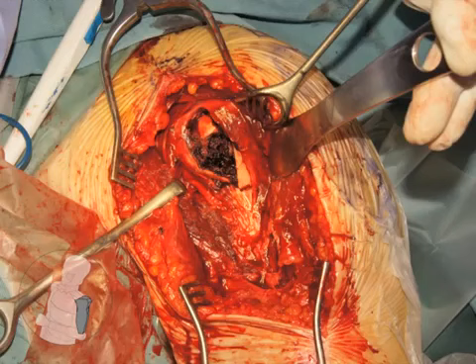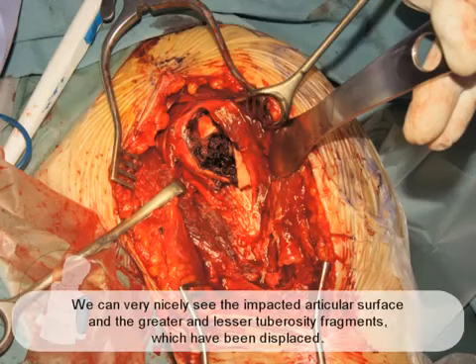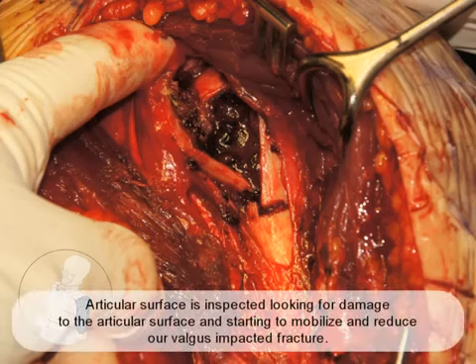And here we see with the hematoma evacuated, we can very nicely see the impacted articular surface and the greater and lesser tuberosity fragments which have been displaced. Articular surface is inspected for further extraction of hematoma, looking for damage to the articular surface, and starting to mobilize and reduce our valgus impacted fracture.